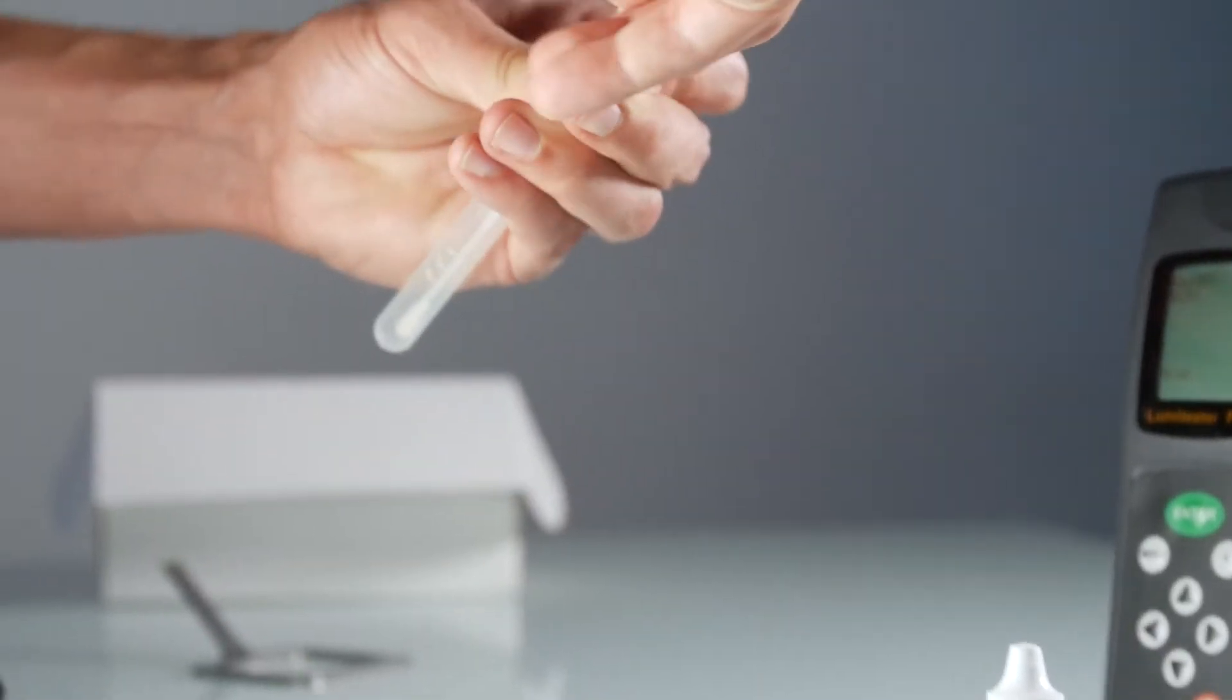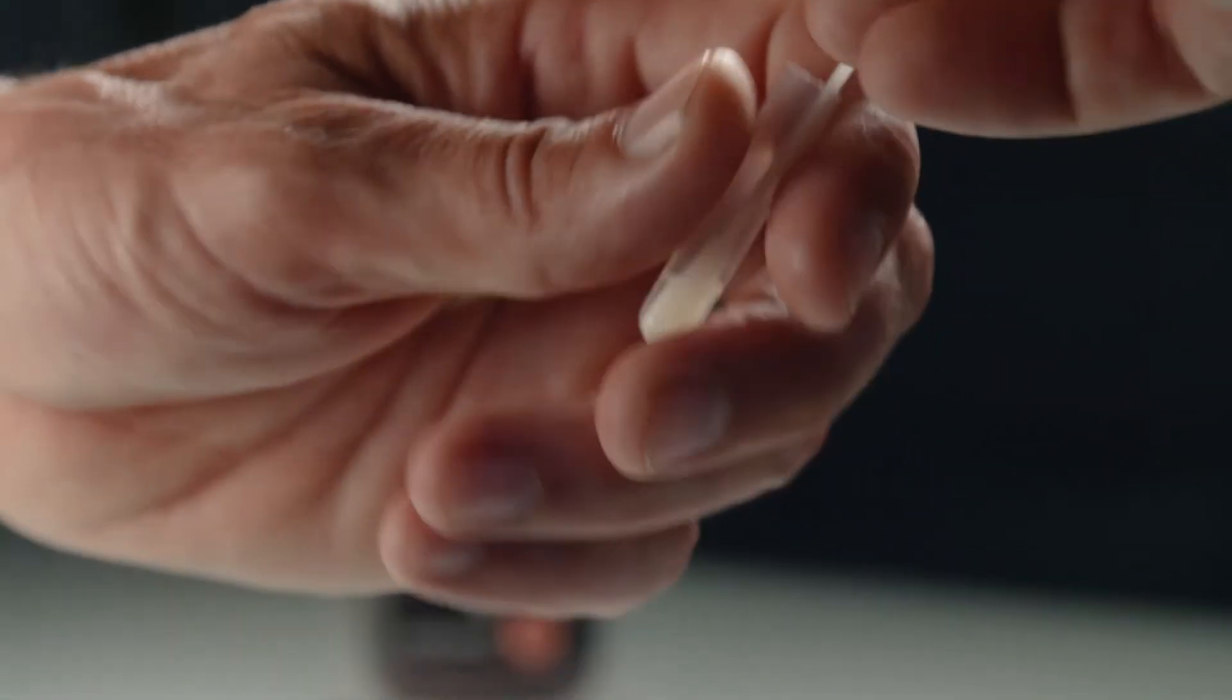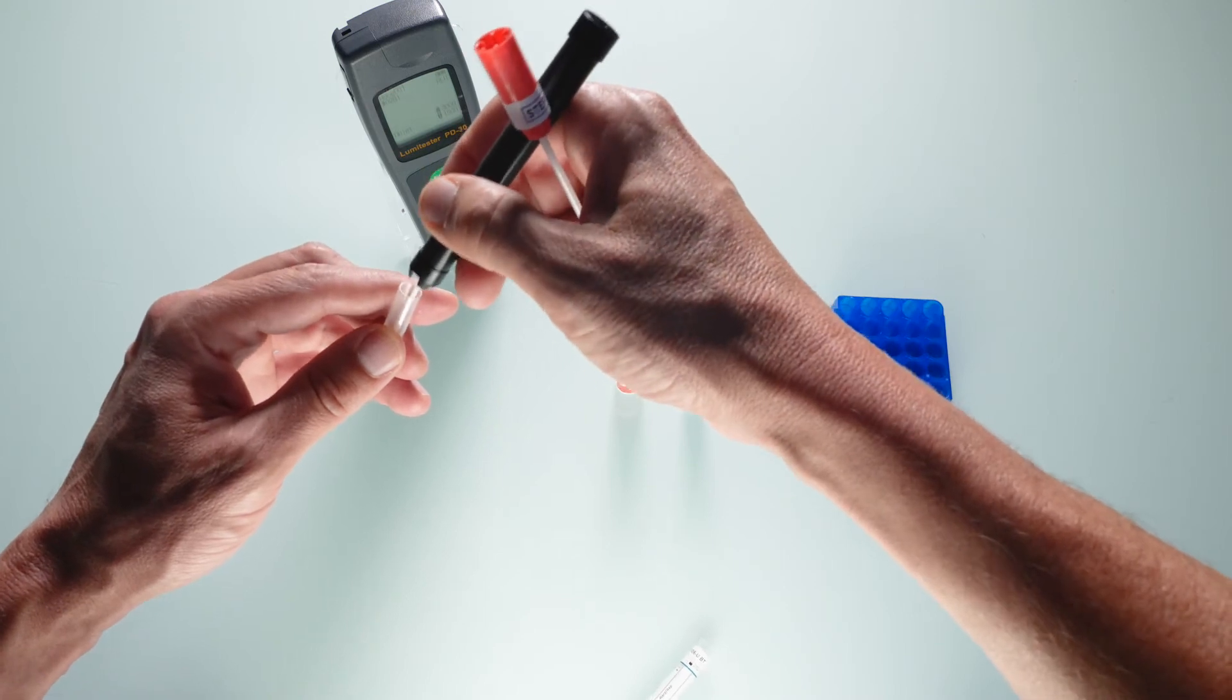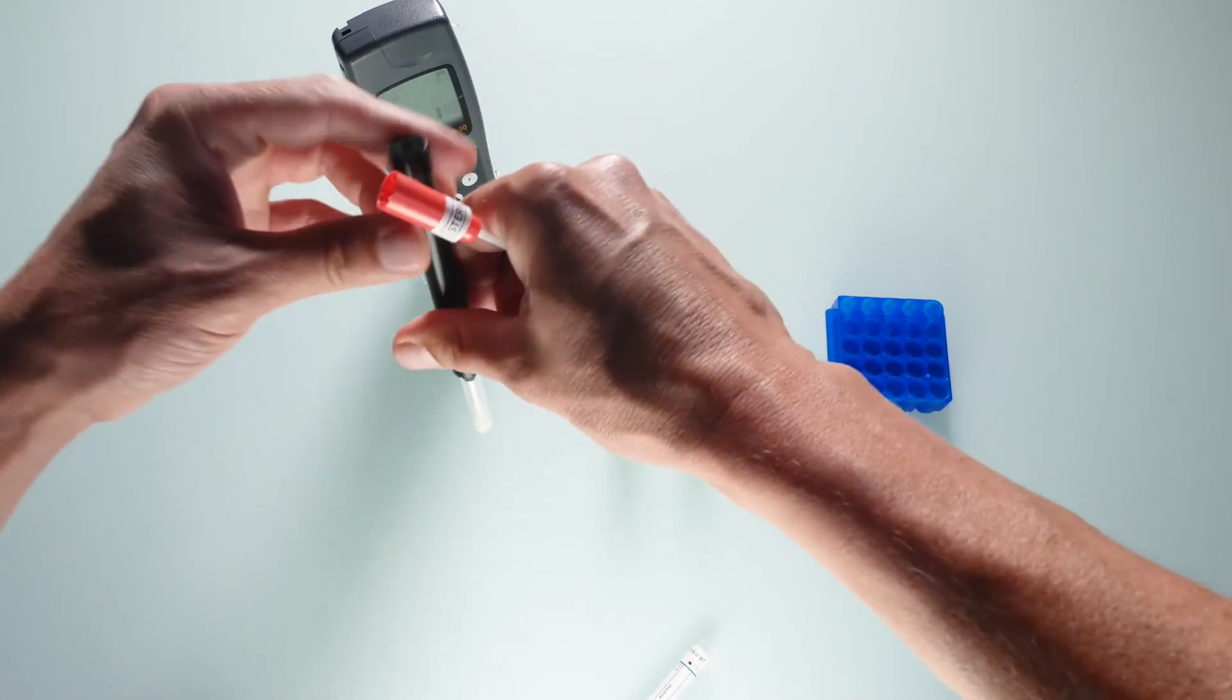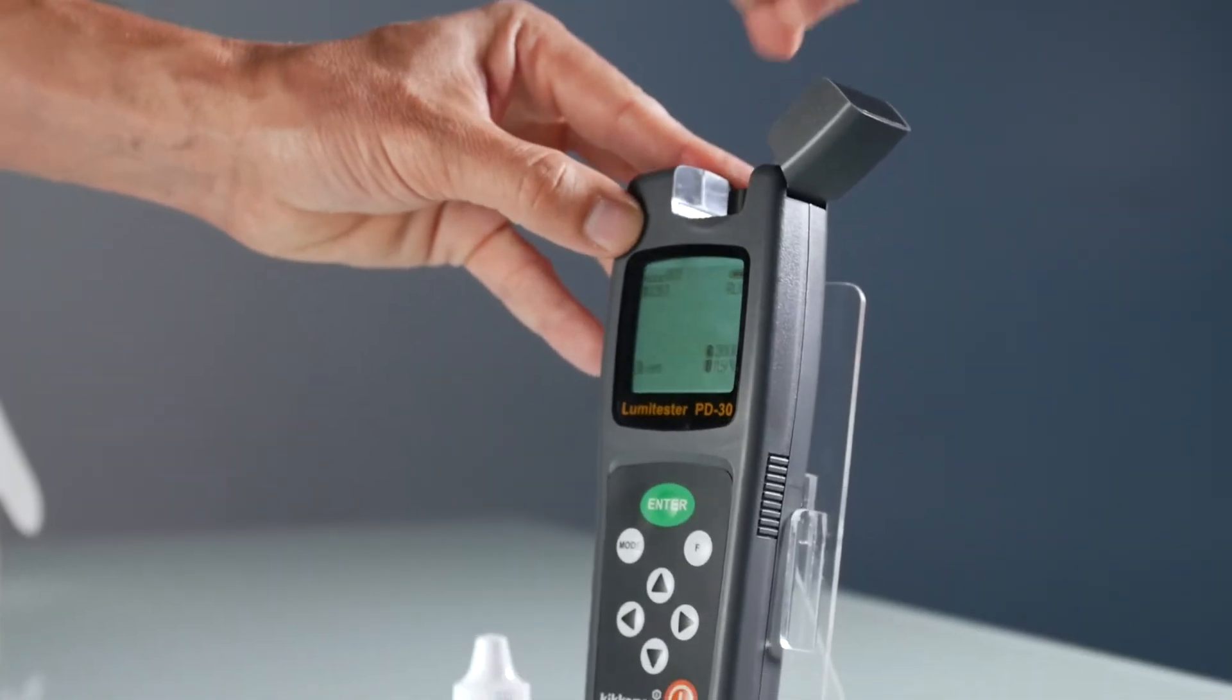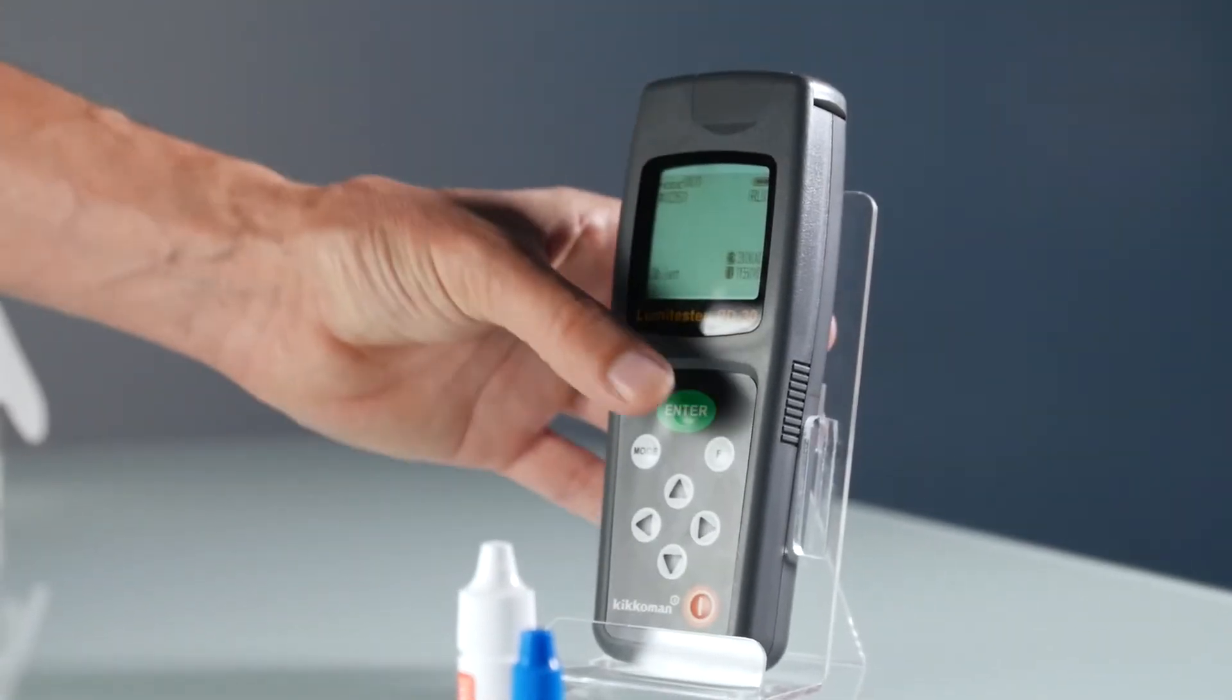Plunge the swab in the LumiTube and break off the end of the swab while maintaining it in the LumiTube. Clip the LumiTube onto the end of the tube holder, slightly agitate, and place them in the luminometer. Close the lid and press enter to start the measurement.